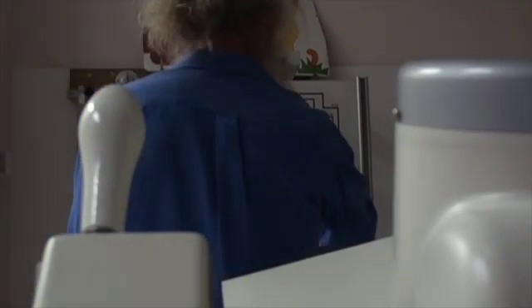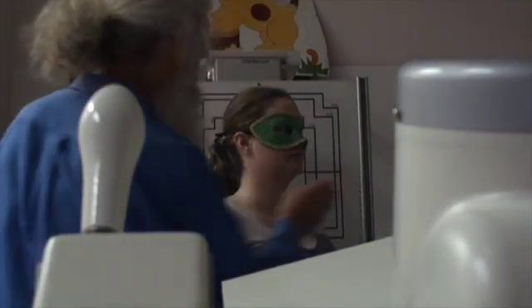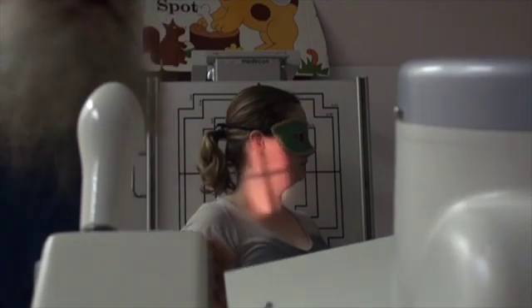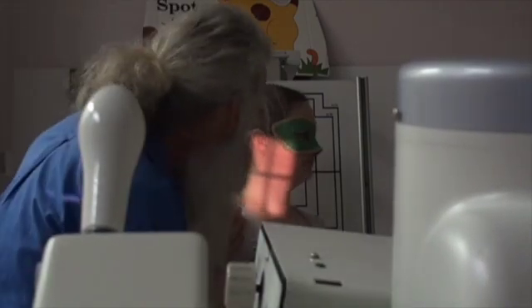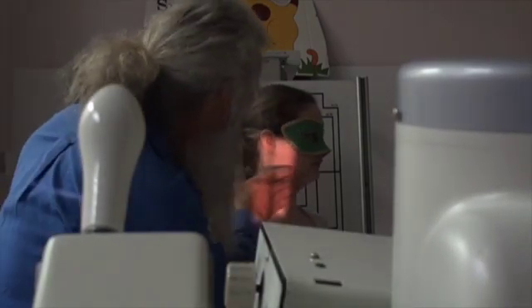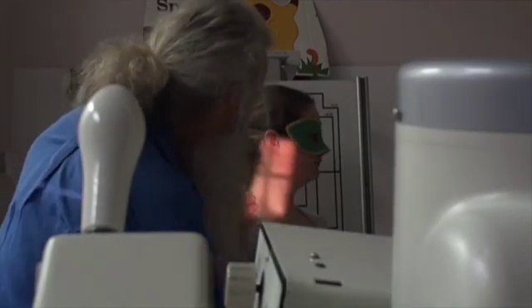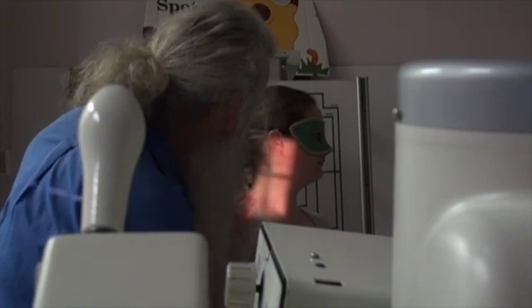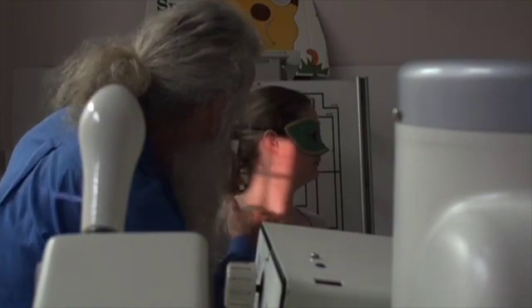We rotate around to the other side for the other oblique — 45 degrees with the shoulders, head turned around again. Collimation is set again so that we exclude the thyroid from a direct dose, going down to the clavicle.